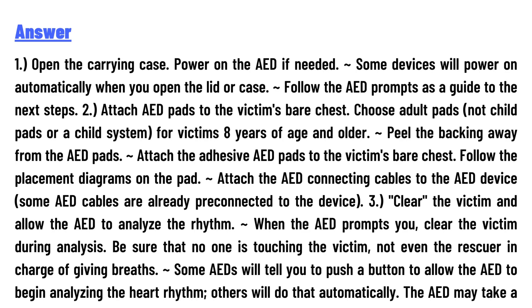Step 1: Open the carrying case and power on the AED. Some devices will power on automatically when you open the lid or case. Follow the AED prompts as a guide to the next step. Attach the AED pads to the victim's bare chest.